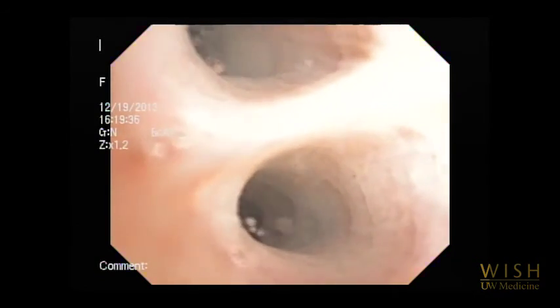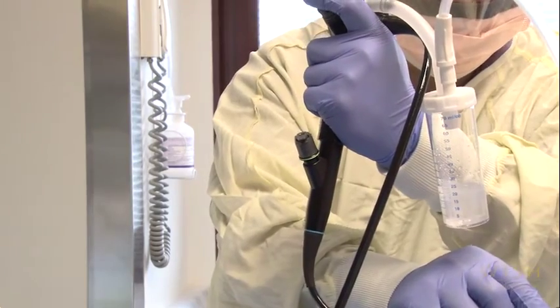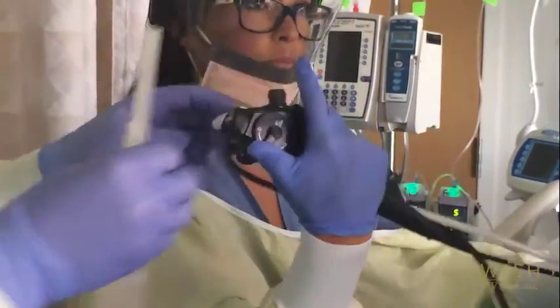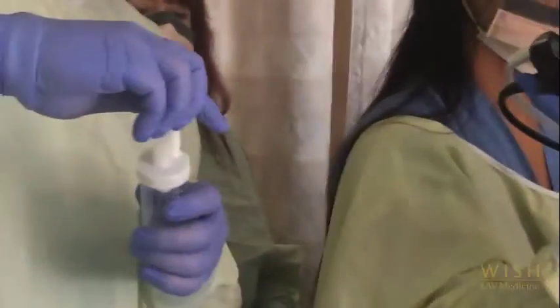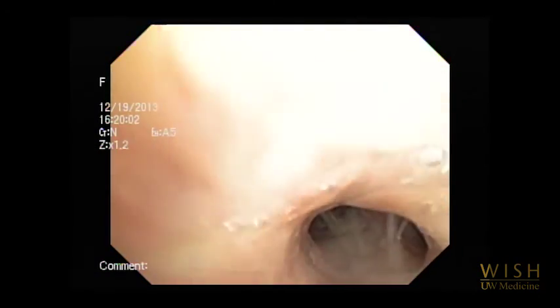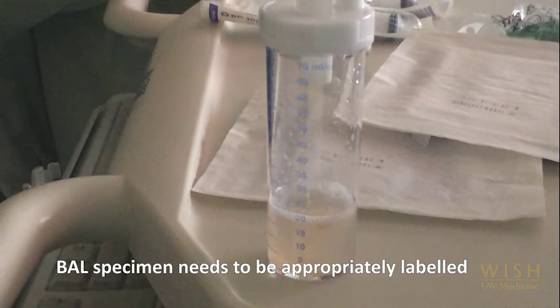Generally, 10 to 25 milliliters of lavage volume is sufficient for routine bacterial and fungal cultures. However, larger volumes may be required depending upon the specific tests to be run. Once the BAL is completed, the bronchoscope can be withdrawn or redirected. The collected sample is properly labeled and transported to the laboratory for analysis. It is unnecessary to routinely obtain a post-bronchoscopy radiograph unless there is a clinical indication.